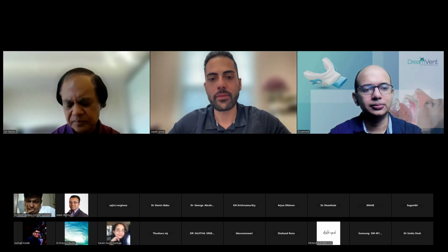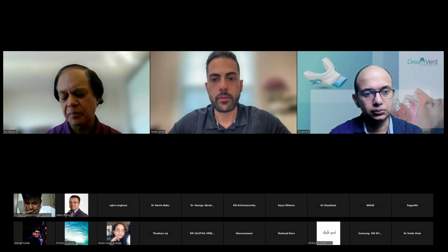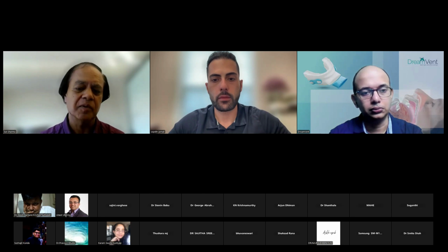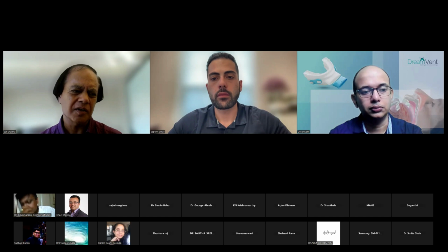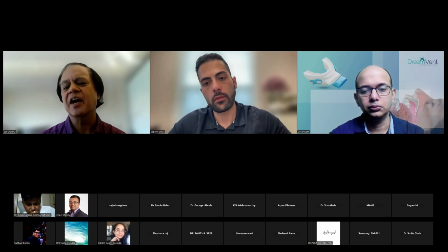In pregnancy, I completely agree with Dr. Jamali. There's no difference. You can go to Dreamvent appliance versus CPAP. My thinking sometimes is that you want to put in the cost factor, because it's probably going to be a short-term problem, since the patient is likely to lose weight subsequent to the pregnancy and things will improve. But they need to be treated. So if the cost is favoring CPAP in Canada, that may happen, versus appliance. So I may factor that into the equation.